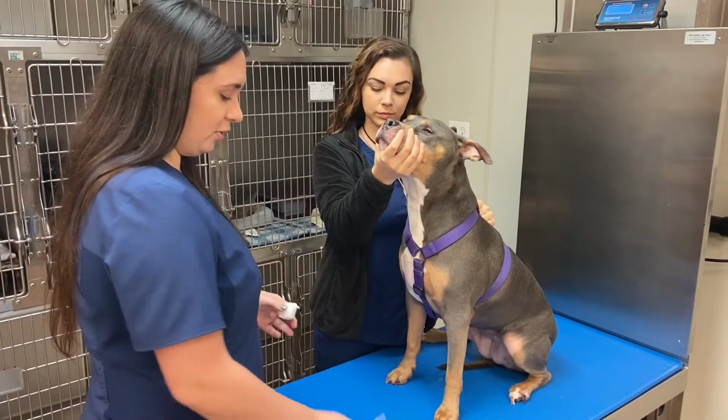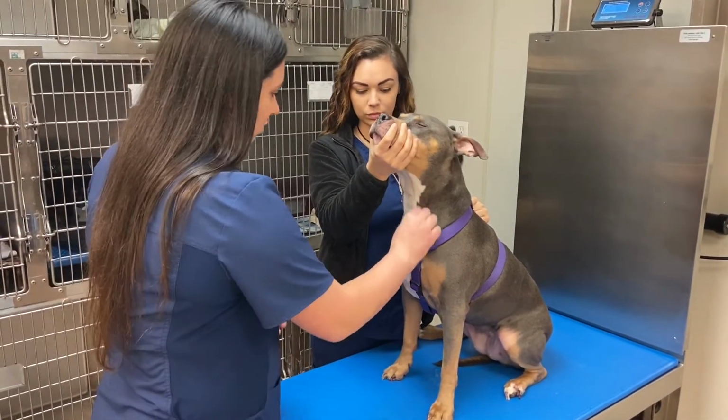My name is Alexandra Watson. I'm currently enrolled in Veterinary Pathology 1, and I'll be performing a serologic test and a chemistry profile. I'm going to be drawing blood for a heartworm test and a chemistry profile.